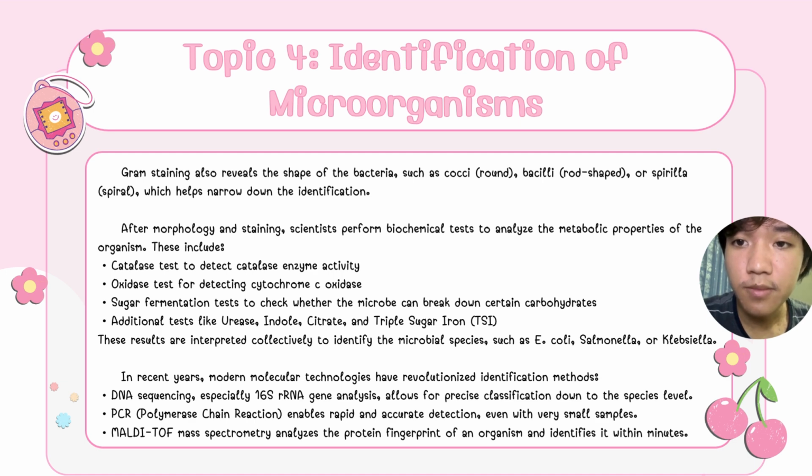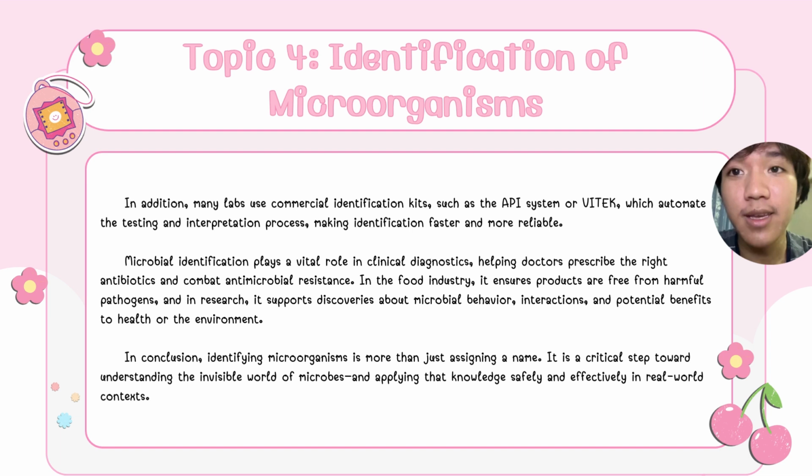MALDI-TOF mass spectrometry analyzes the protein fingerprint of an organism and identifies it within minutes. In addition, many labs use commercial identification kits such as the API system or VITEK, which automate the testing and interpretation process, making identification faster and more reliable.